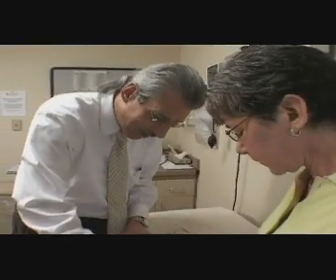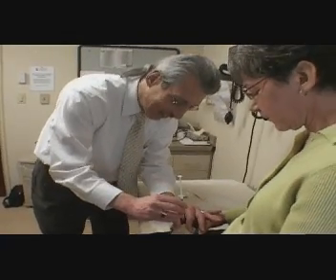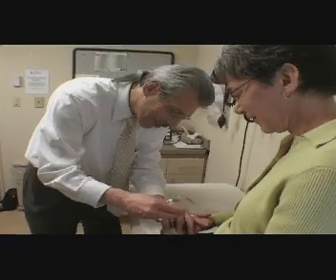Maybe Stan would like to practice too. I'm getting a little better. Oh, I think he should practice — that's a good idea. Were you watching when I was doing it? Yes. I got it. Not sure how good I'll be at it, but I got it. It's really not that difficult. So I'm going to swab it with the cotton. It might be helpful if caregivers practice too. I'm going to squeeze this. It's almost as if I'm doing it for real. Straight out. Did that hurt? Ow! Sorry. It hurt you more than it hurt me. Are you comfortable doing that? I'm going to have to be.